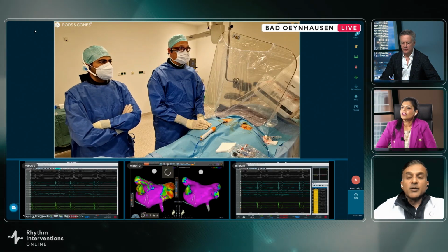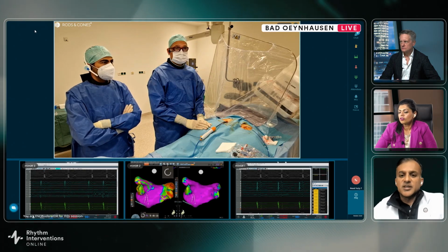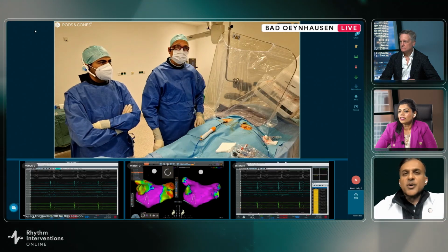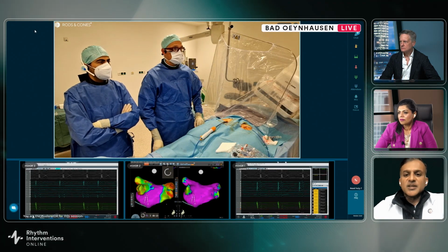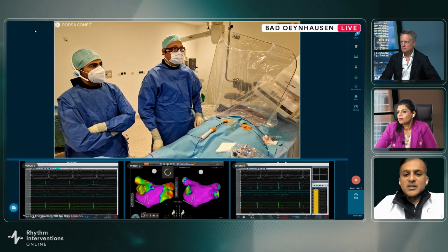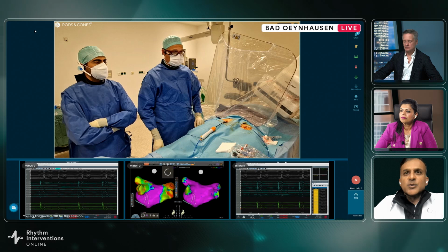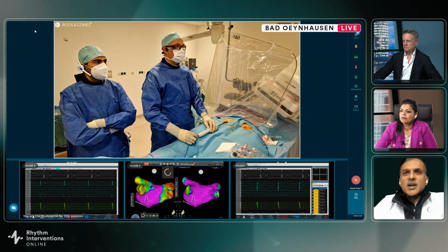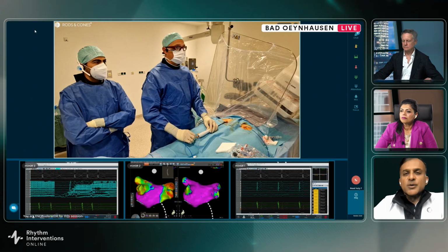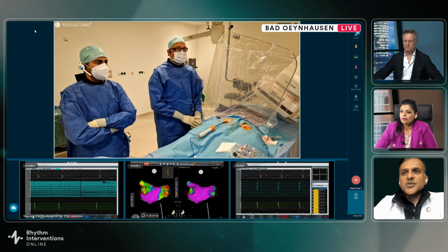Go ahead, Kousik. No, I'm saying that in the post-market, the real AF data showed less than 1%, like a 0.8% neurologic event rate. And even that one event that was reported was possibly an ocular migraine. So it was either one event out of, a 0.8% or zero.